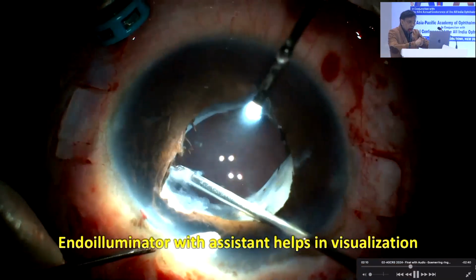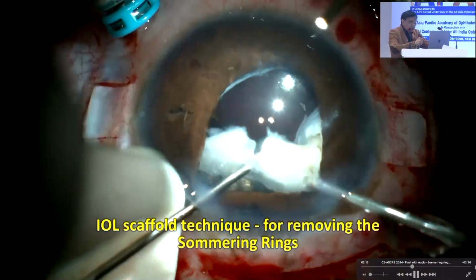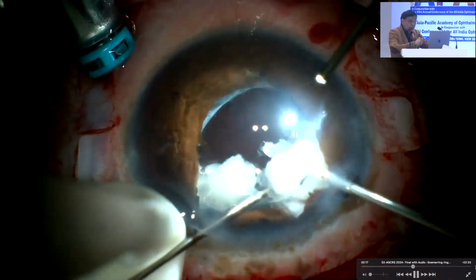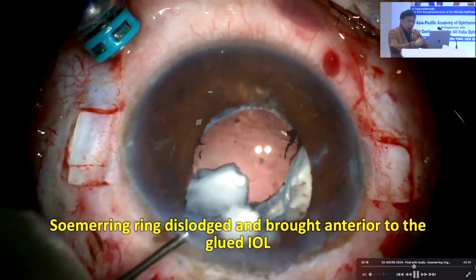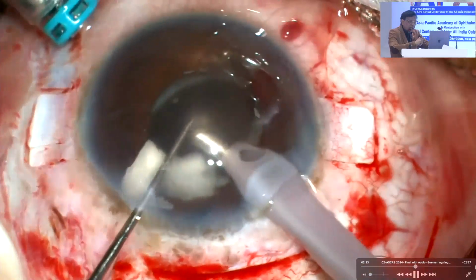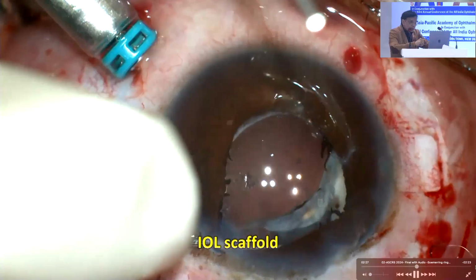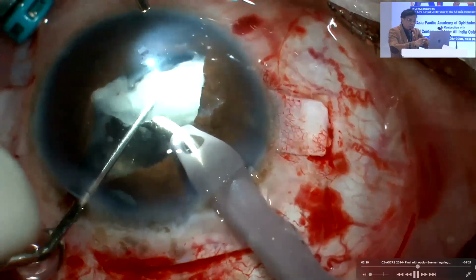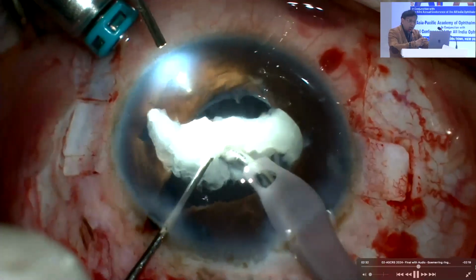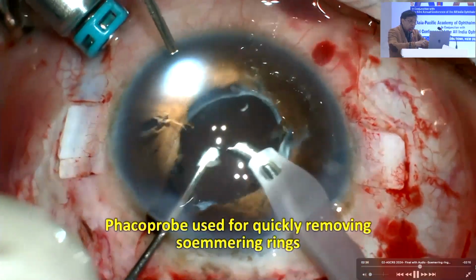So here you can see, once I have done that, I'm now trying to bring the Soemmering ring in front of the IOL. Once they are in front of the IOL, you see my life will become much easier, because I can now go in with the phaco probe and emulsify them. So this is the way I would suggest to manage Soemmering rings. See how many Soemmering rings there are. They are large, they are thick. You don't want them falling down. So this is the best thing.